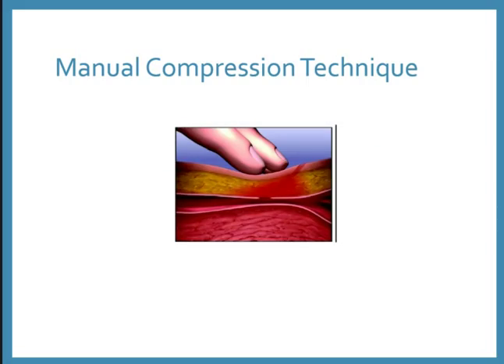Manual compression technique looks a little bit like this. You're going to place 2 fingers over the site where the catheter entered the artery and 1 finger over where it entered the skin.